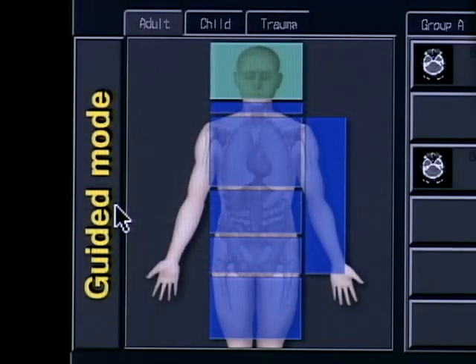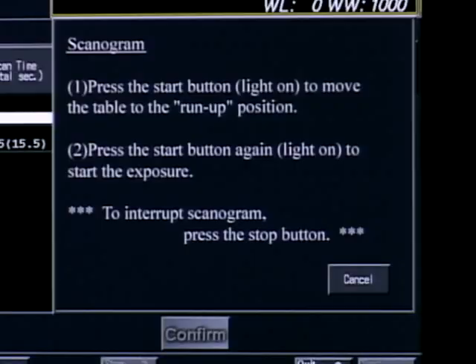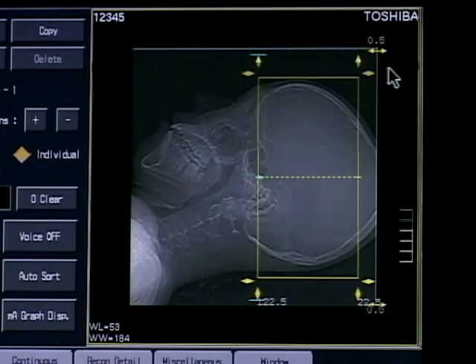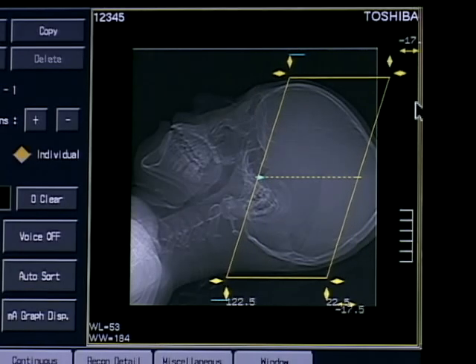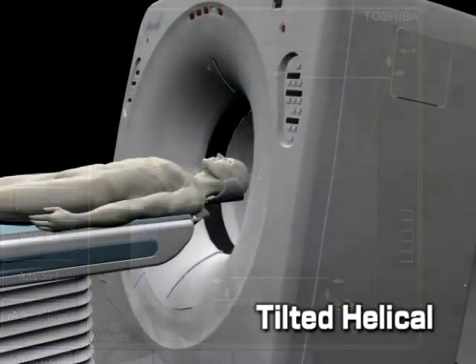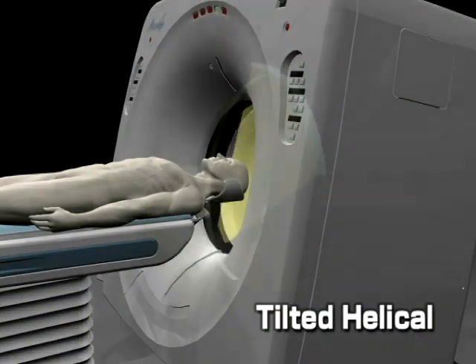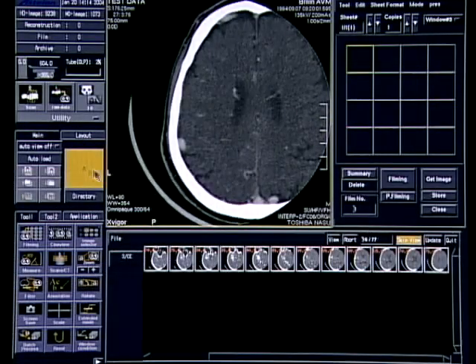Guide mode can be used even by inexperienced CT system operators. Tilted helical scanning enables CT images of the head to be acquired without exposing the eye's crystalline lens to X-rays.